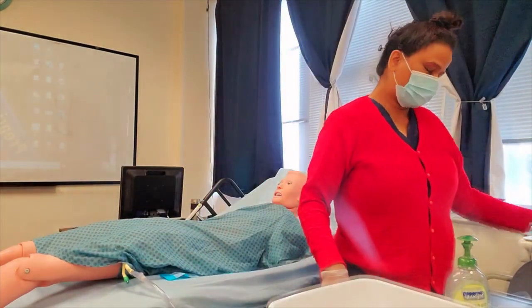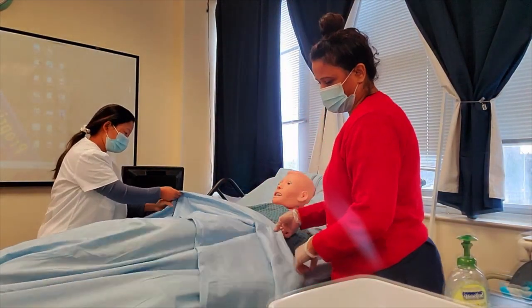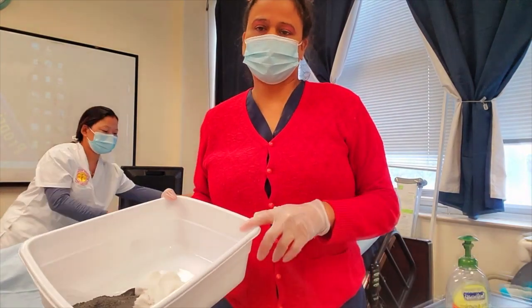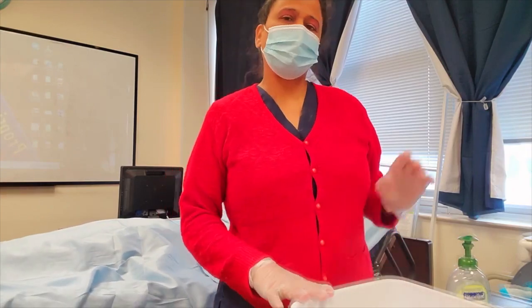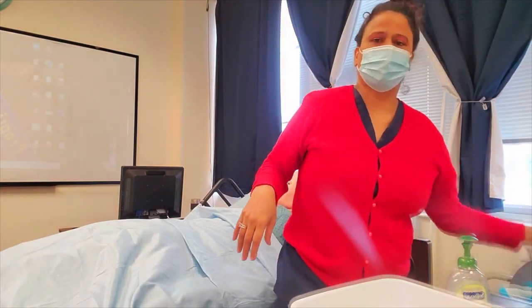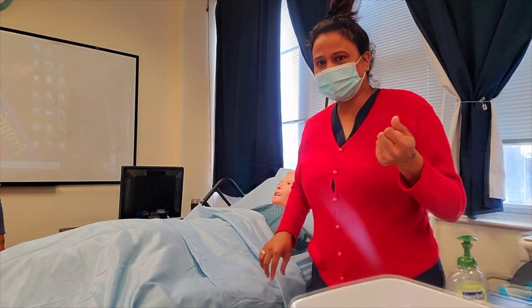Place the soiled chuck into the trash and cover your patient. Mrs. Jones, I'll be right back to wash my hands and dispose of everything. Dispose of the wash water, disinfect the basin three times, dry it with a towel, and place it back in its designated area. Take your gloves off, dispose of them in the trash, and wash your hands for 15 to 20 seconds.